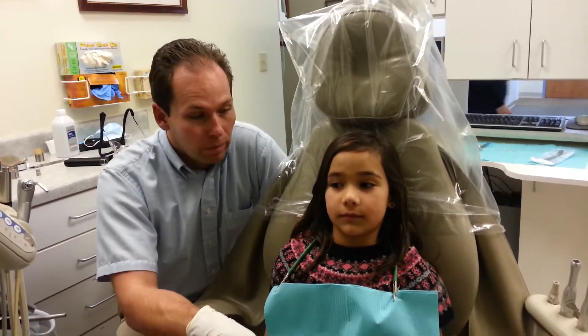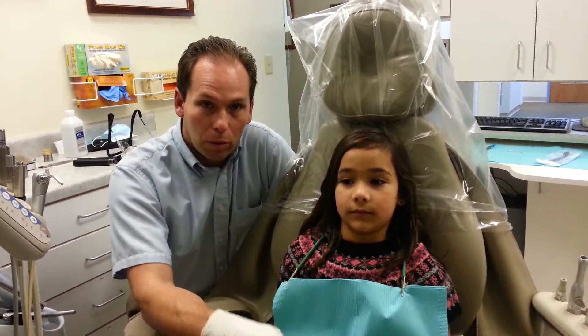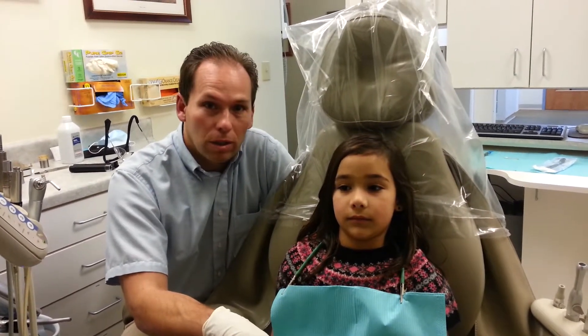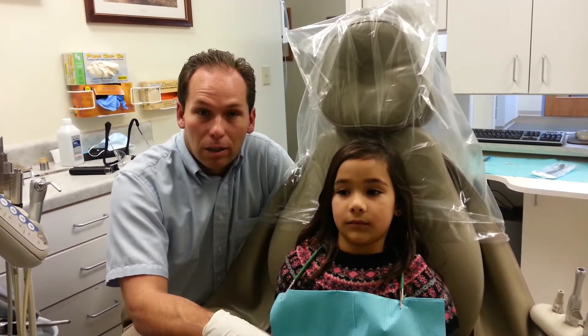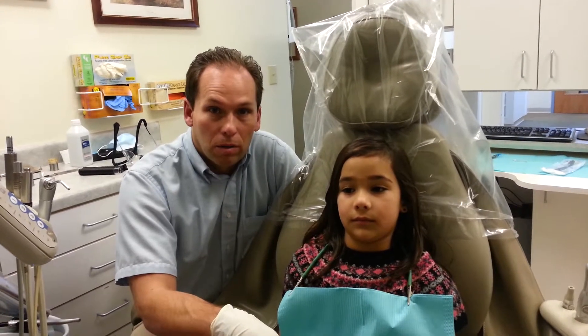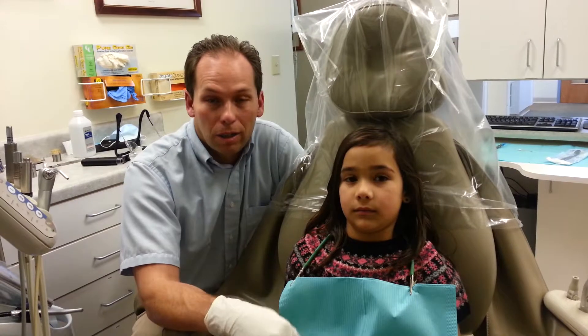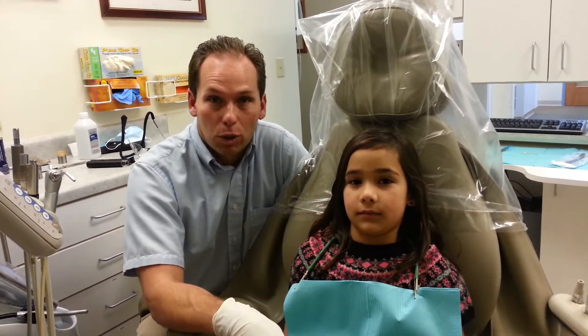I'm here today with Rachel, and Rachel has a heavy frenum up here on her upper lip. We're going to do what's called a frenectomy — I'm going to use the laser to remove that frenum. These heavy frenums can create several issues, one of which is contributing to gaps between the teeth.